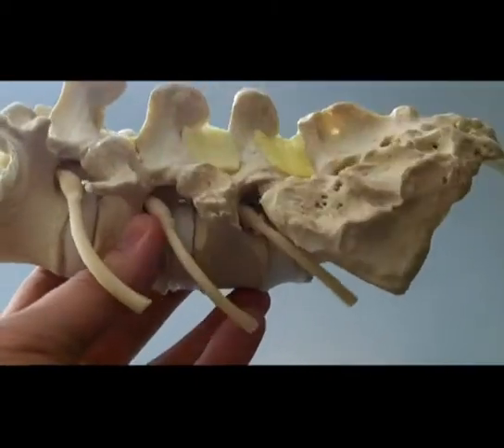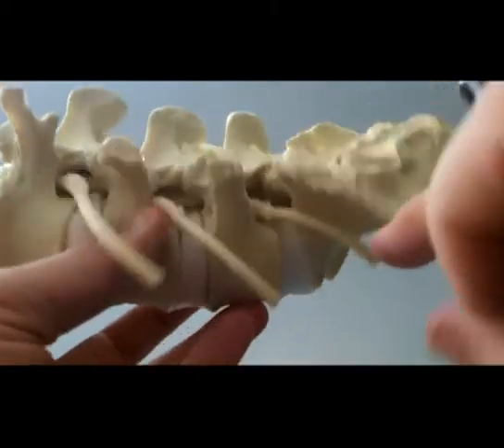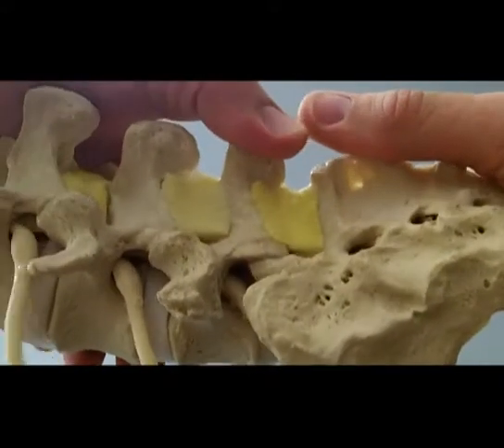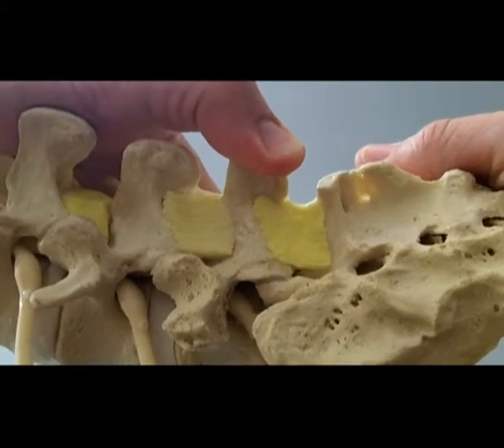So one of the techniques I use once I identify where the pain generators are, whether it's the disc or the facet joints, I'll render flexion distraction, which is a technique to open those facet joints. You can see that.